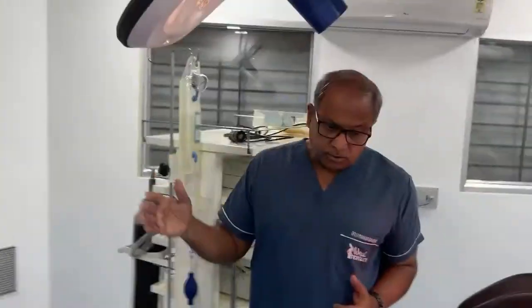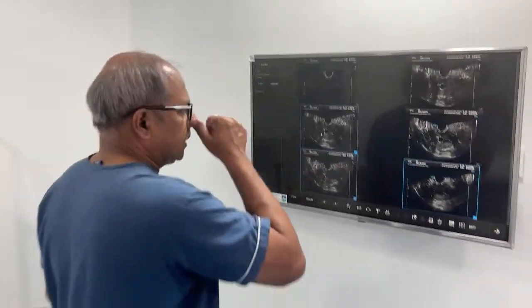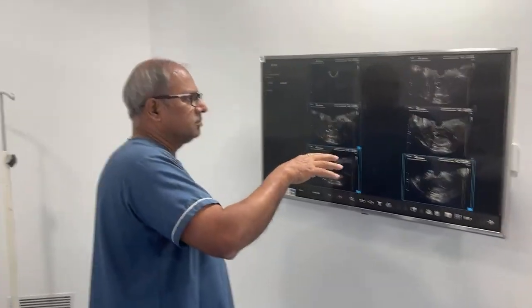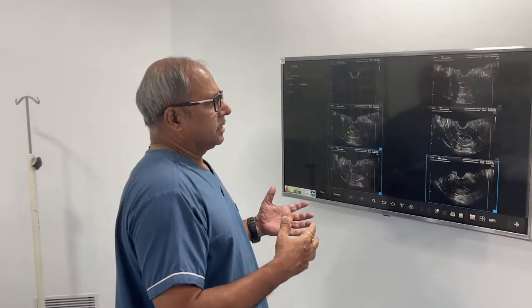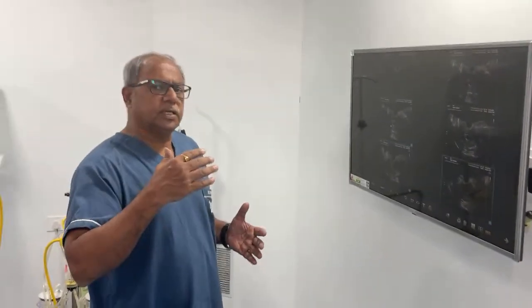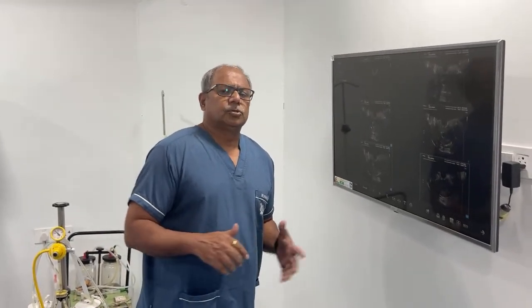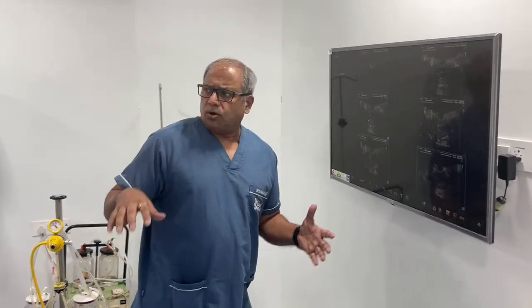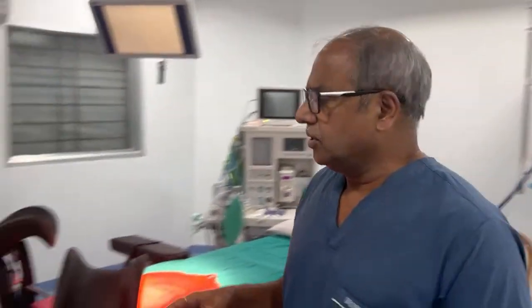And I can show these ultrasound pictures also here. If we do a transmission, these can also be transmitted to zones 1, 2 and 3. Zone 3 is my auditorium, and if we have a workshop in fetal medicine, we can do it. Whatever you are seeing is through a console.